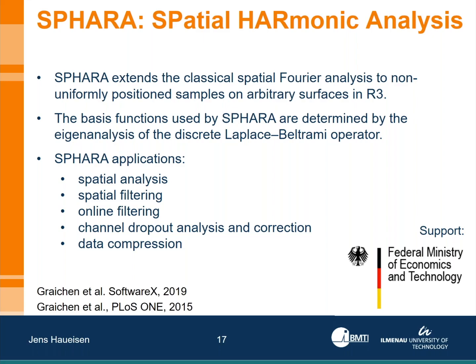That provides sort of motion buffering. So when your electrode is slightly moving because of head movements or something else, this gel typically provides some sort of mechanical buffering. And that means that we have more movement artifacts in dry electrodes compared to wet electrodes.